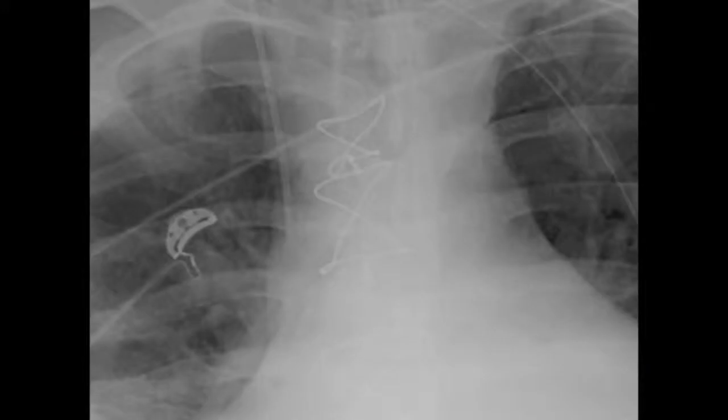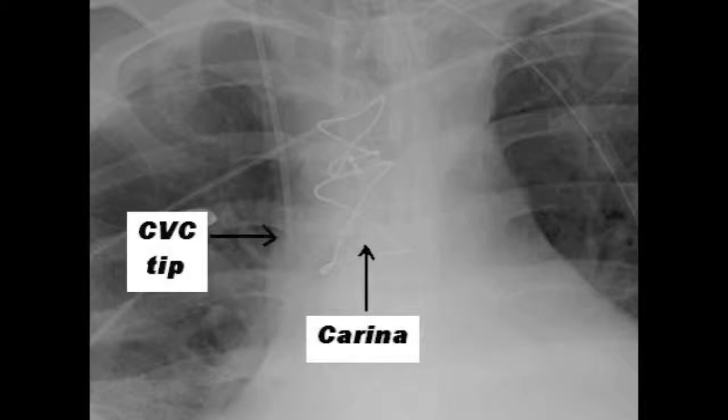The ideal position of a central venous line is contentious. Case reports of pericardial tamponade following inadvertent atrial puncture have led to recommendations that the tip should sit within the SVC, above the reflection of the pericardium. The best marker of this on a chest X-ray is thought to be the level of the carina.